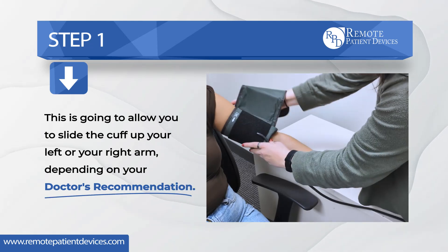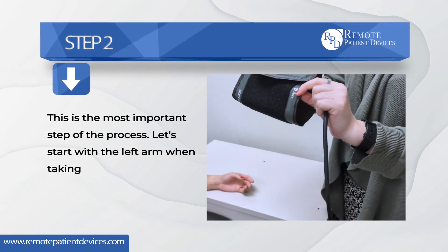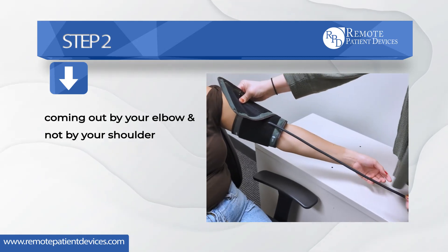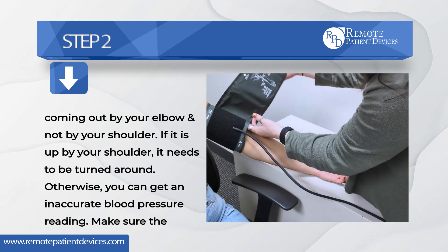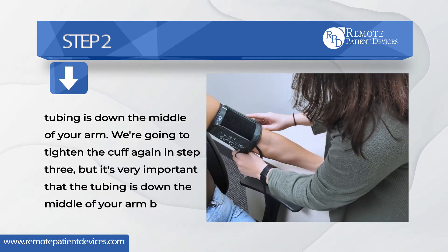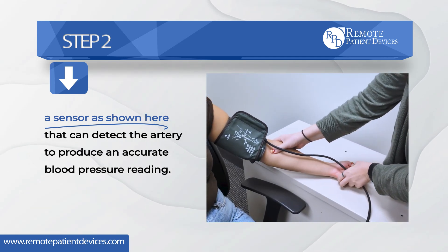Step two — this is the most important step of the process. Let's start with the left arm. When you take the cuff and slide it up your left arm, make sure the tubing is coming out by your elbow and not by your shoulder. If it is up by your shoulder, it needs to be turned around, otherwise you can get an inaccurate blood pressure reading. Make sure the tubing is down the middle of your arm, because on the inside there is a sensor, as shown here, that can detect the artery to produce an accurate blood pressure reading.